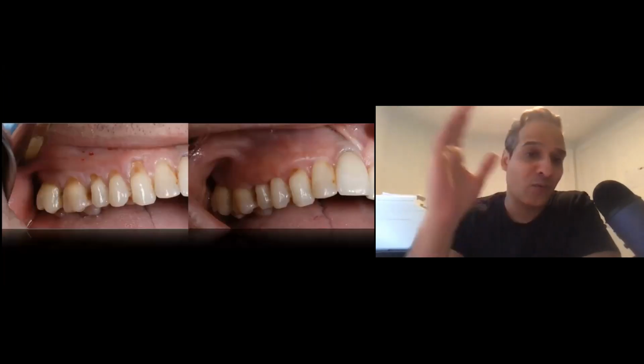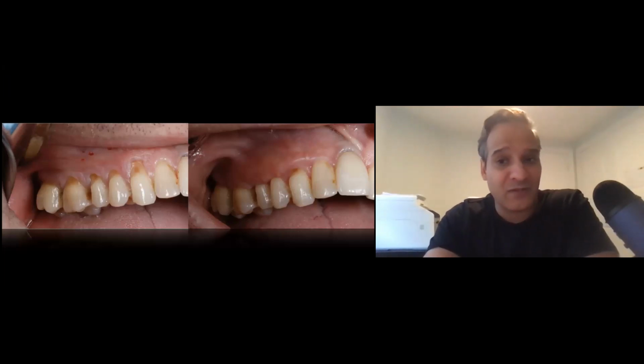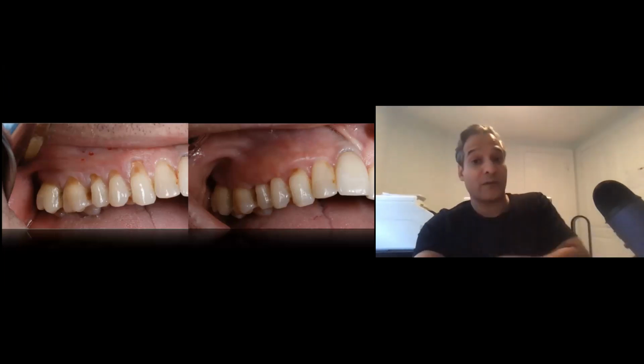So we went in, we did the same concept as before, a coronally positioned flap. And these are the results afterwards. So now he's ready to go see the dentist to finalize and touch up and recontour some of those restorations and add some restoration to make it look a little bit more aesthetic.